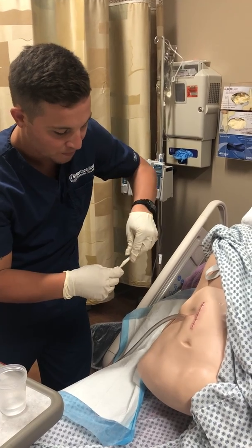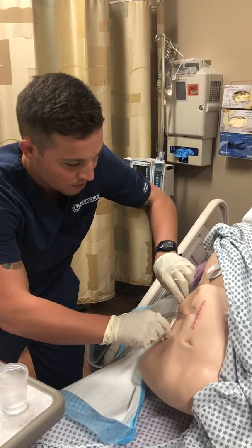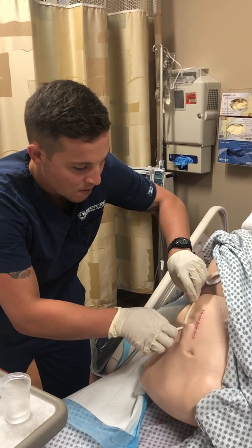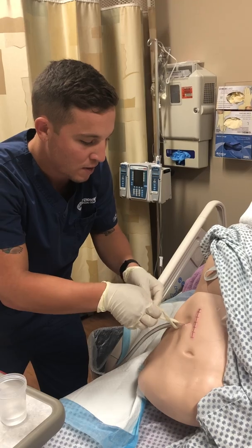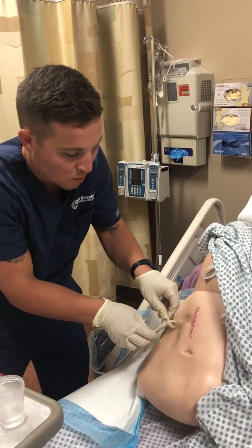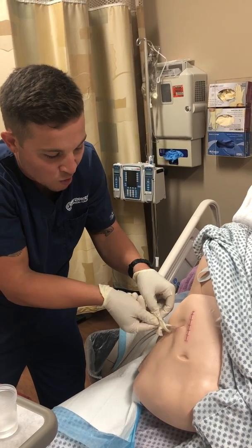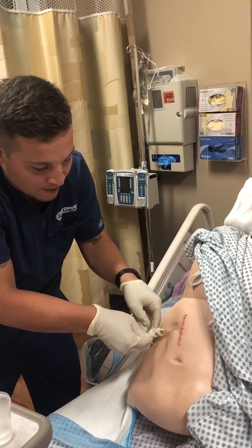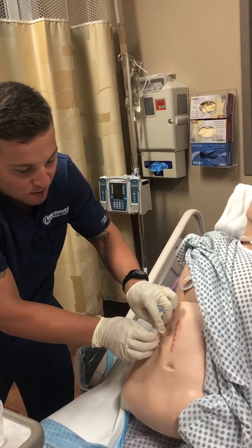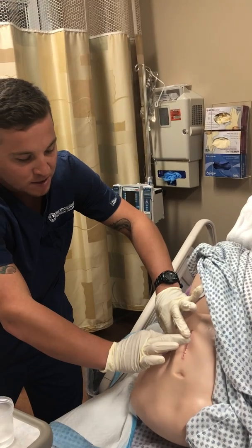So one way to do this is I'm going to go up and around this, like that. One more. Like that. Come up, and then we're making our occlusive like this. Okay. Making sure that's up.